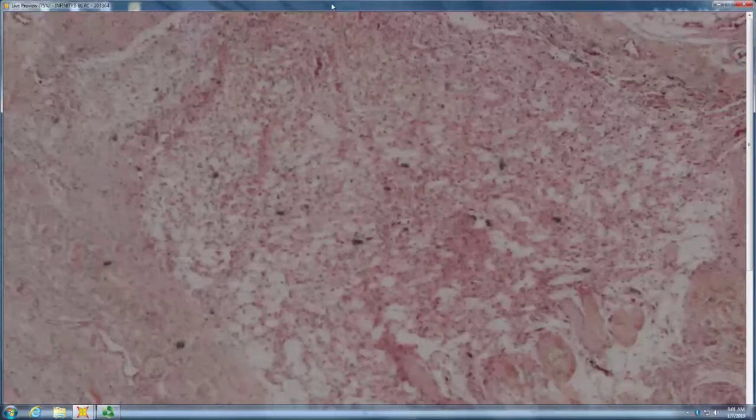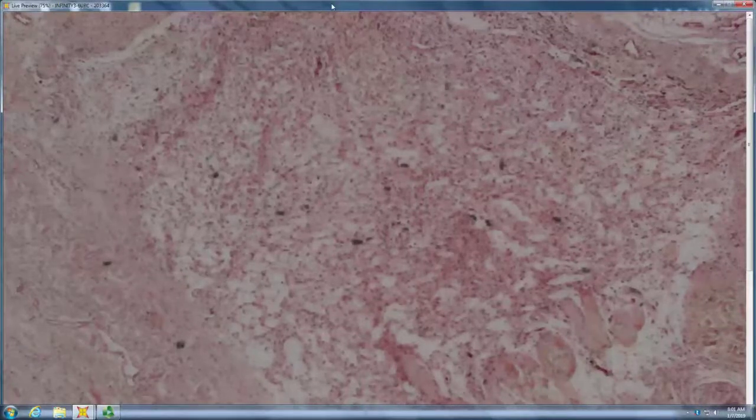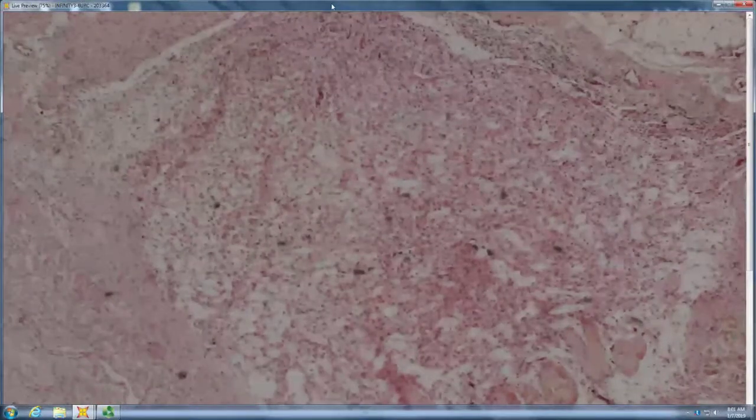Likelihood with this being on the scalp is it's some sort of heterotopic glial tissue, right? Often they have aplasia cutis over them. If it's a fully developed meningocele, you've got all those vascular-like clefts and the wrapping around collagen. This just looks like it's probably just heterotopic glial tissue. You're halfway to an encephalocele, basically.